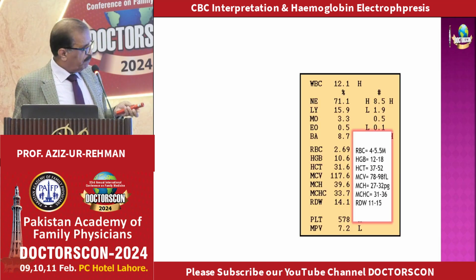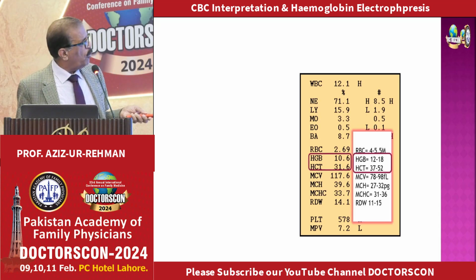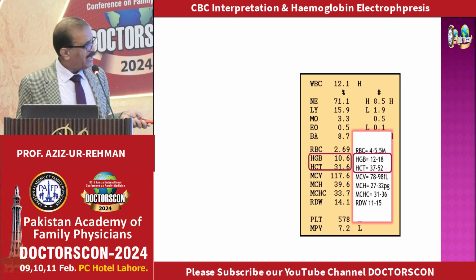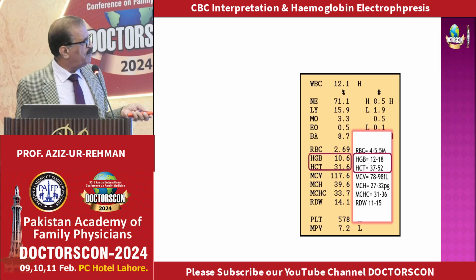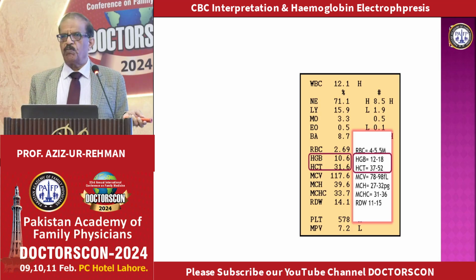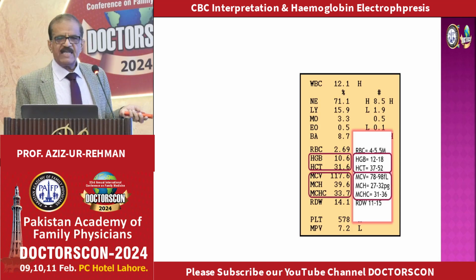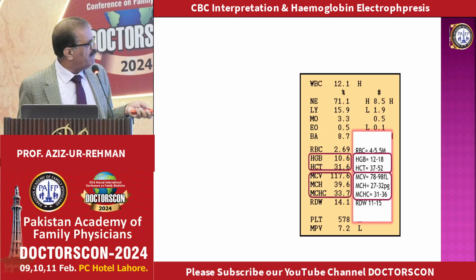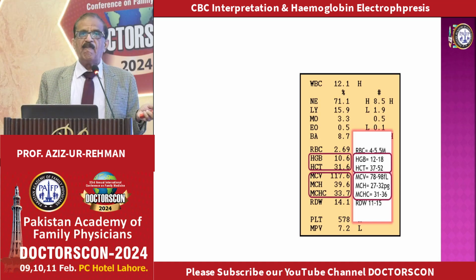Now we are still practicing. This is another case scenario. You have this CBC report. First step, HB is reduced, hematocrit is reduced, both have to be reduced. So this is a case of anemia. Second step, look at the MCV, it is actually increased as compared to normal. MCV is increased, so we'll call it macrocytic.